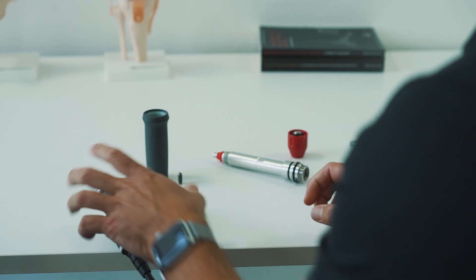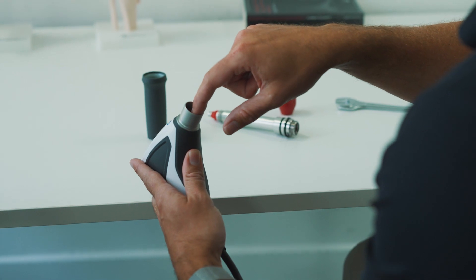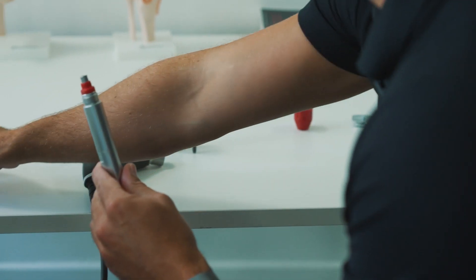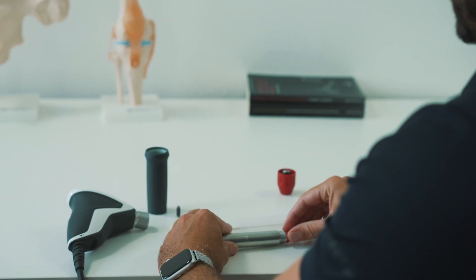Then, to clean your handpiece, clean around the inside of the barrel, removing any dust or debris that may have accumulated there. And, using your cleaning brush, clean down through the guide tube, again removing any dust or debris.